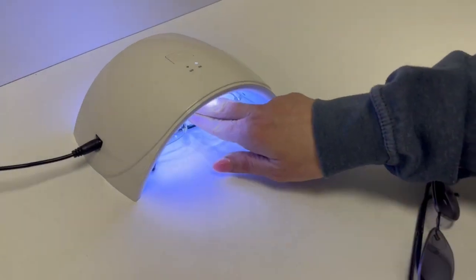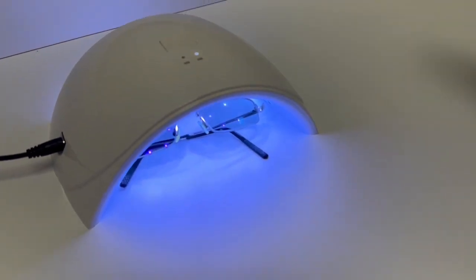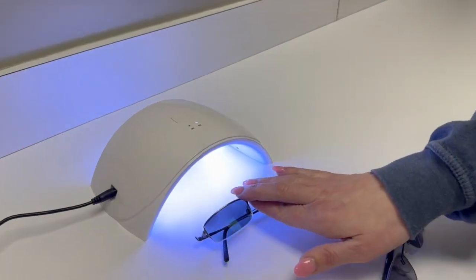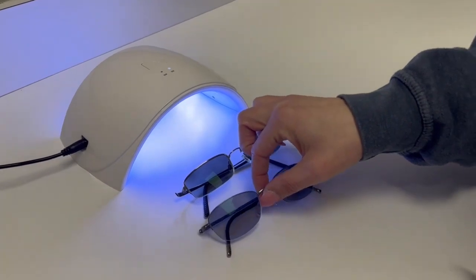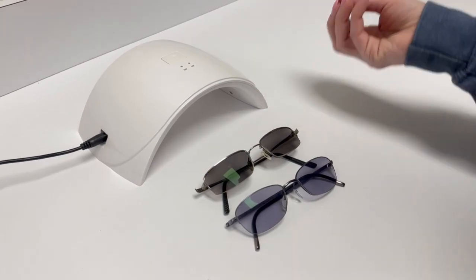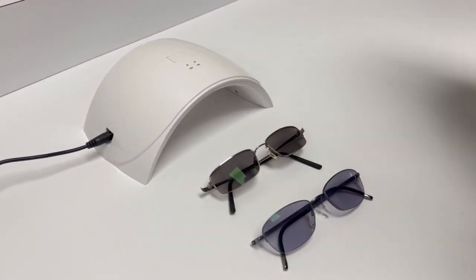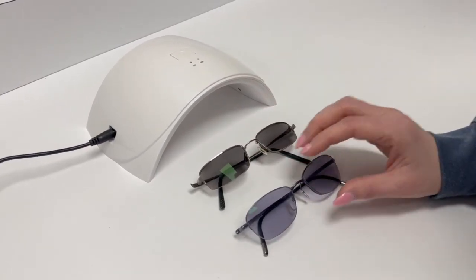The photochromic tester does have a 30-second setting and a 60-second setting. As you can see, you do not need anywhere near the 30 seconds, let alone the 60 seconds. This is a very quick and convenient way to show your patients that their lenses are transitions, and also for you to test them when they come back from the lab, just to make sure that the lab did actually go ahead and make them as transition lenses.